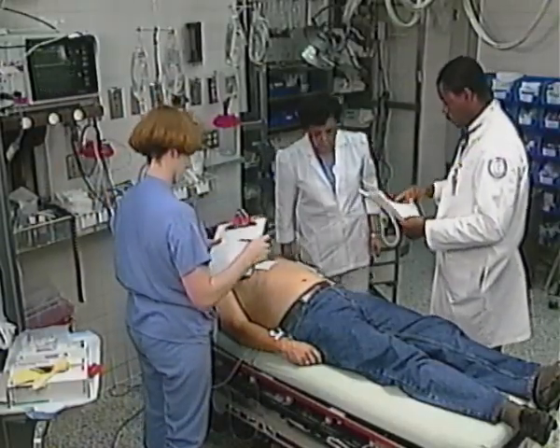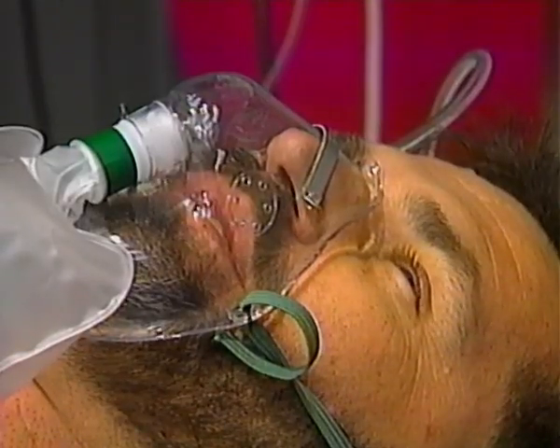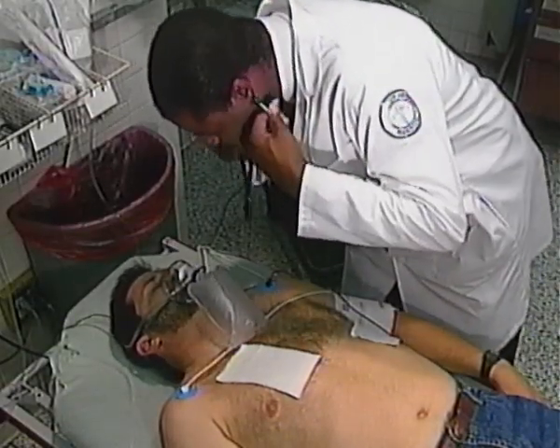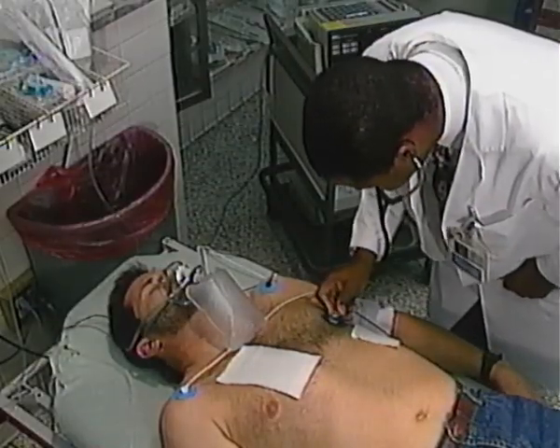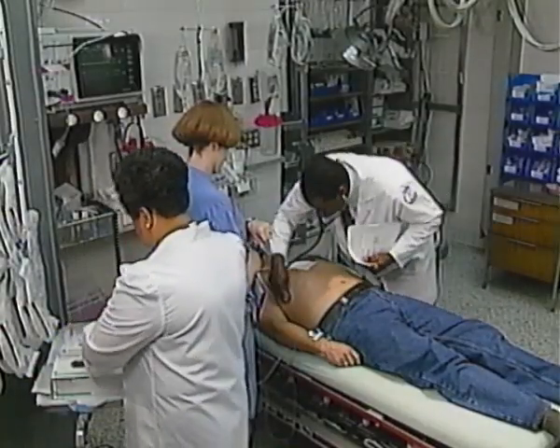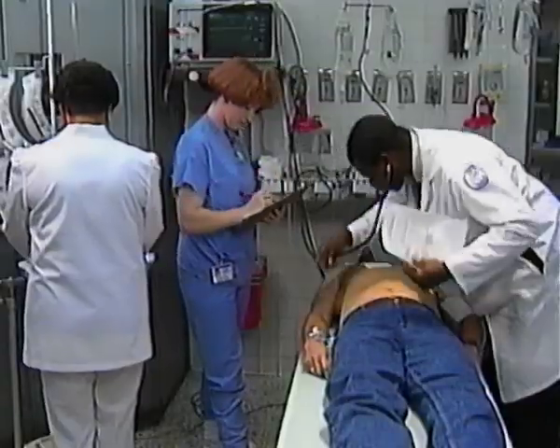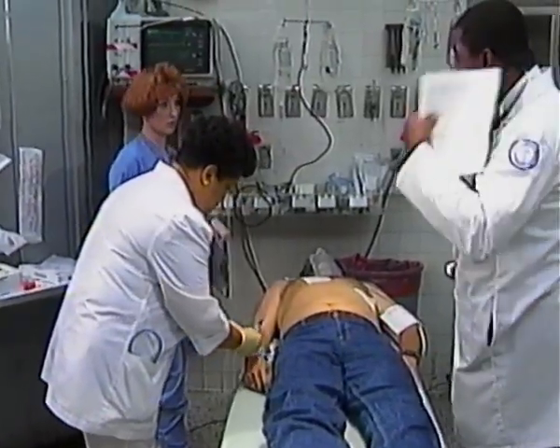Okay. Thanks. Mr. Jackson, how are you doing, sir? I'm feeling better now. Oh, that's good. His respirations are still 24, but they're not as labored.